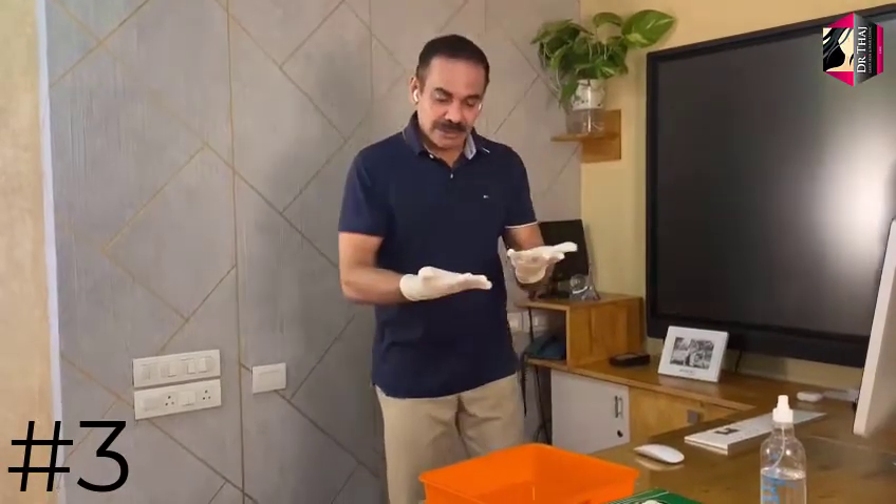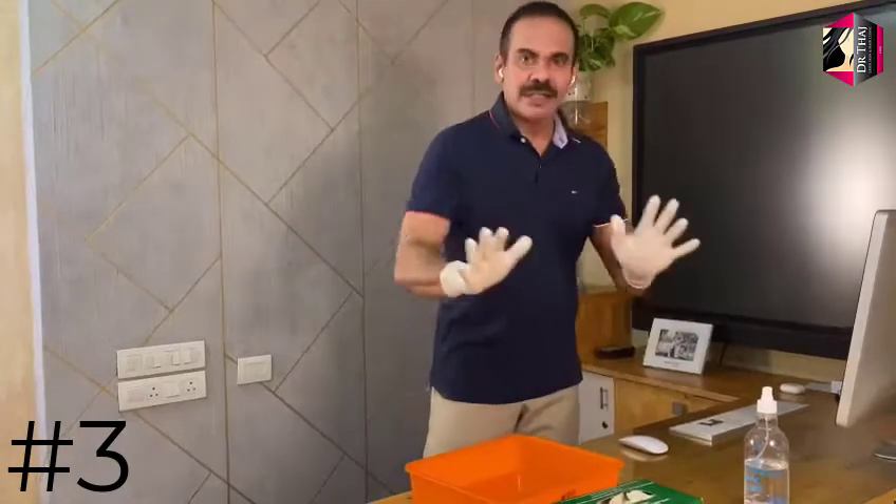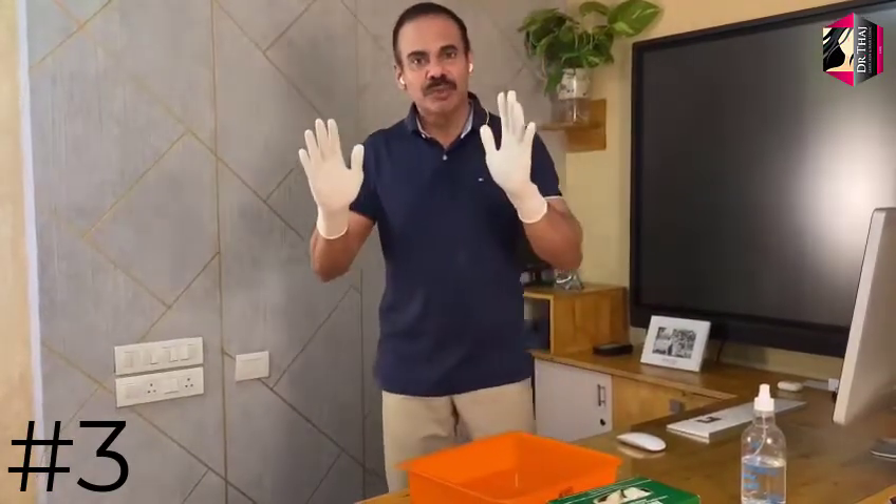Now, how to dispose of the gloves — that is doffing of the gloves. Just imagine your gloves are soiled; you have touched here and there. So, how do you dispose of the gloves?